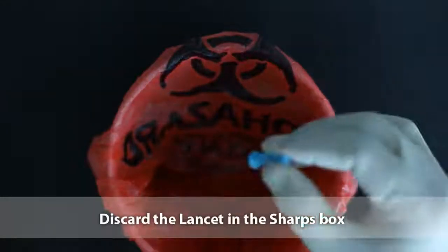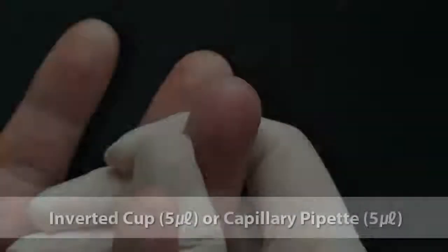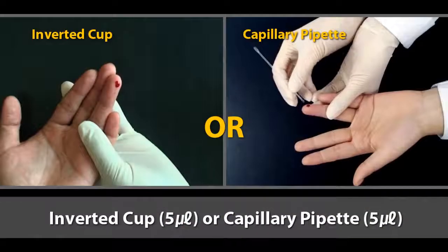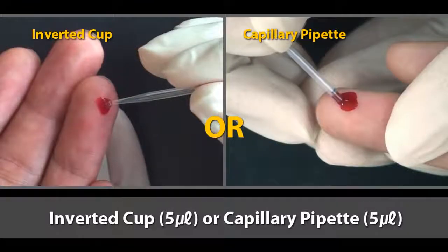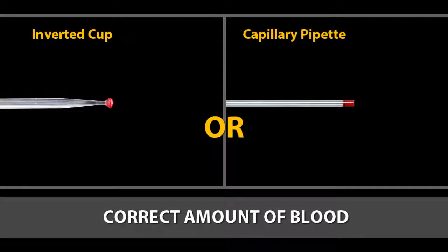Discard the lancet immediately after pricking the finger. As the blood bubbles up, take a disposable specimen collector and dip the circular end of an inverted cup into the blood specimen. The amount of blood collection is critical. This is the correct amount of blood.